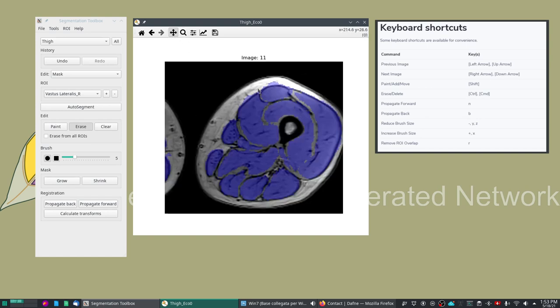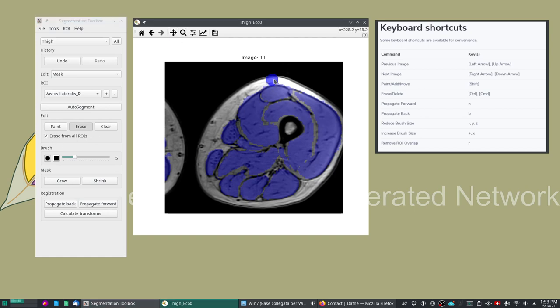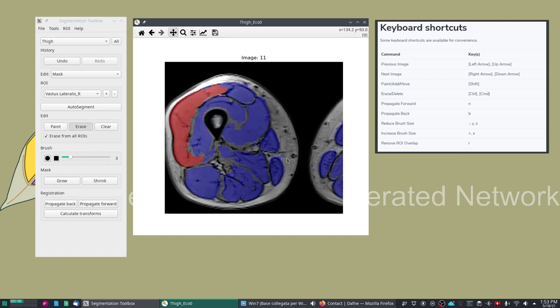Now in normal erase mode in the mask mode erase we can only modify one single ROI at a time, so we would modify only this red ROI. But if we want to just clean up the whole image we can click on erase from all ROIs and this will clear the image from every ROI regardless of what is actually selected.